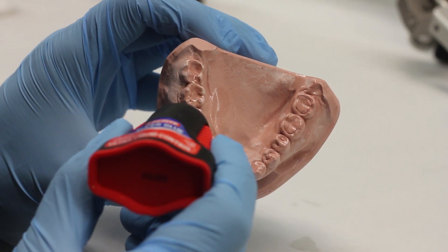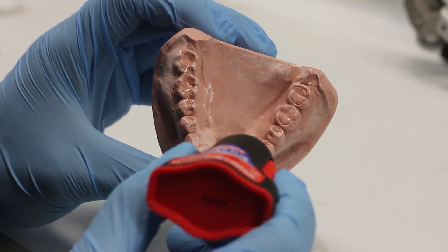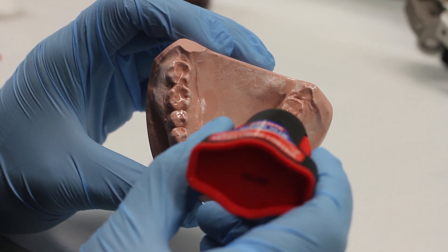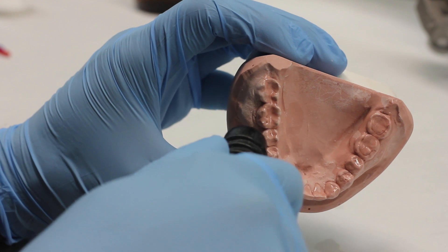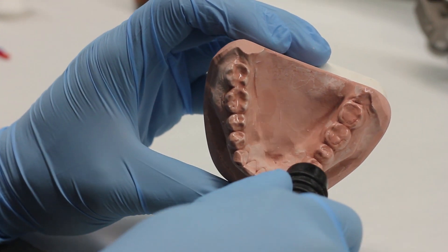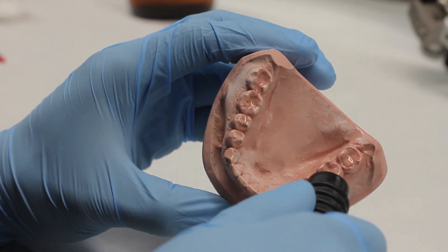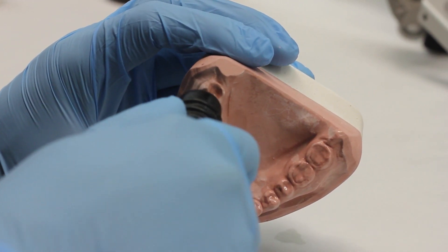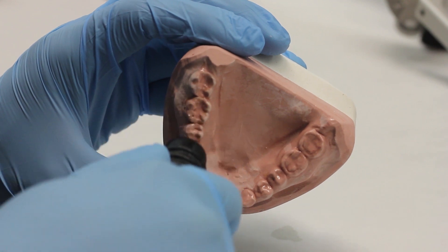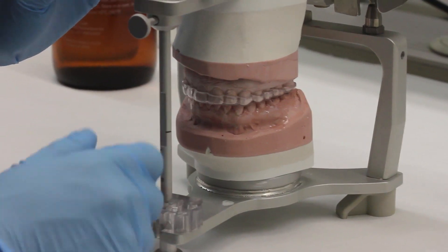The first step in making this occlusal splint is to paint a thin layer of cyanoacrylate or super glue onto your mandibular casts. This helps prevent the casts from abrading and adds a thin layer of hard acrylic over it. We're going to be checking the occlusion quite a bit, so I don't want the casts to abrade. You can take an air water hose and just gently blast a stream of air to thin it out.